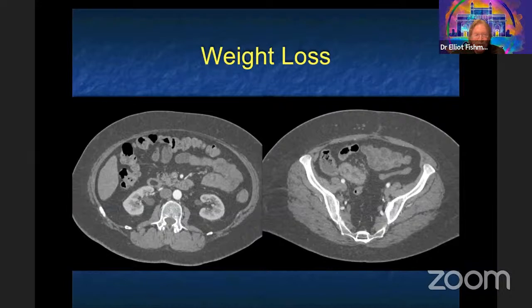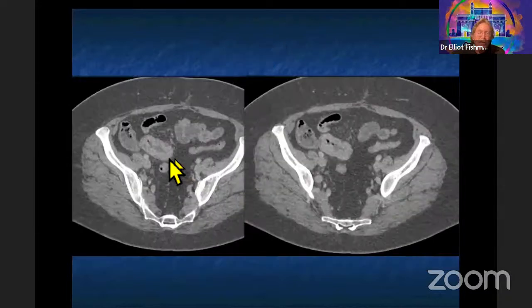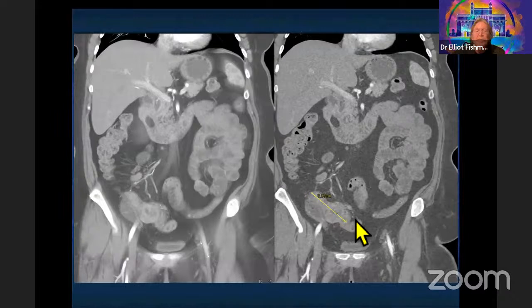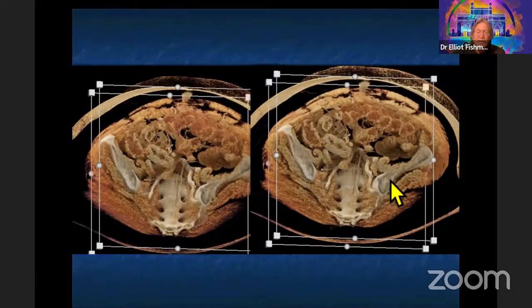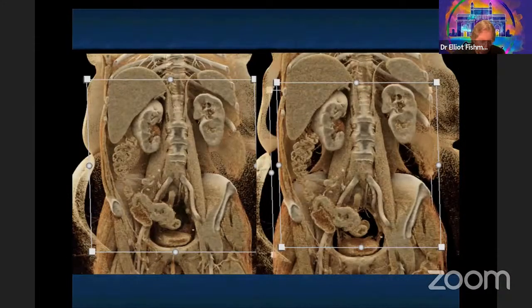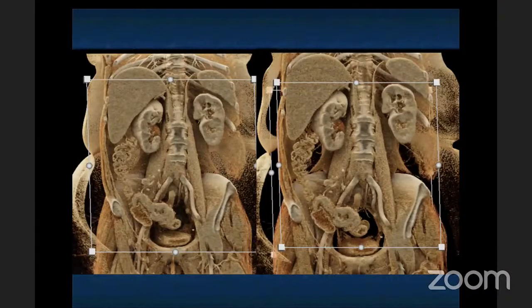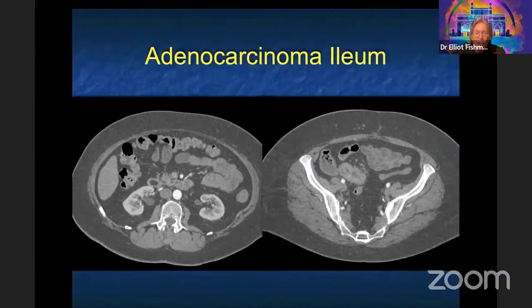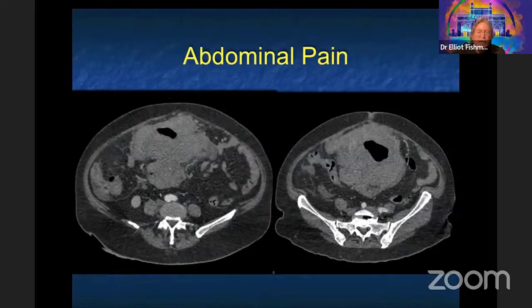Patient with weight loss — next few cases involve bowel. Weight loss and GI bleeding. You can see a nice measurement there; here it is on cinematic. Answers: liposarcoma, Crohn's, ulcerative colitis — a good differential. It's focal. This ended up being adenocarcinoma, but it could be lymphoma. If it were Crohn's, I would worry about Crohn's developing into a carcinoma given the wall thickness.